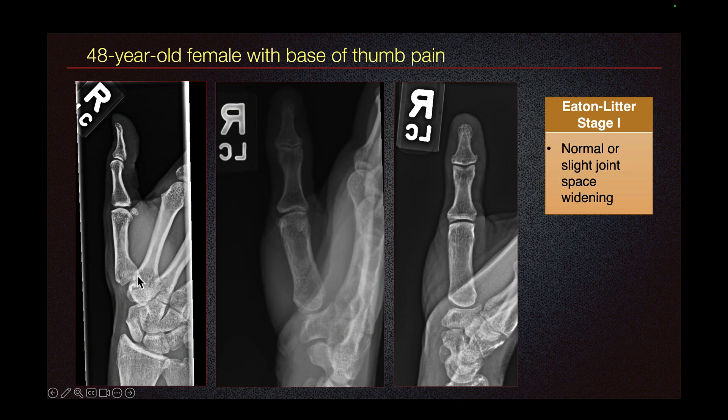This is the lateral view of the thumb. One way to identify this is the two sesamoids of the first metacarpal — they overlap with each other. These are the two sesamoids.